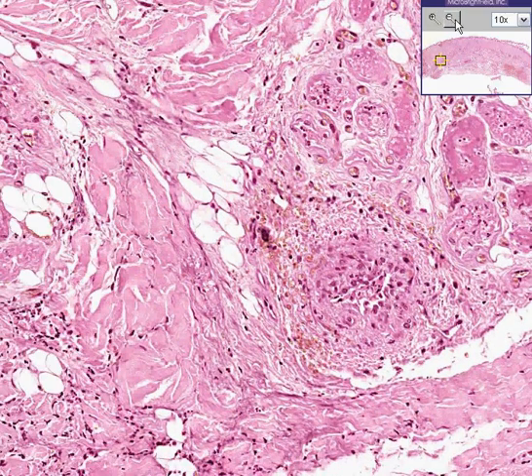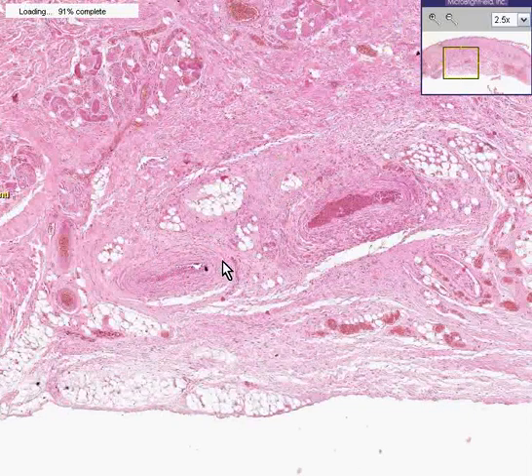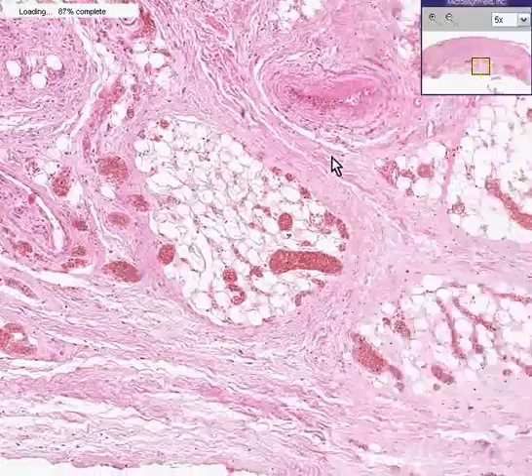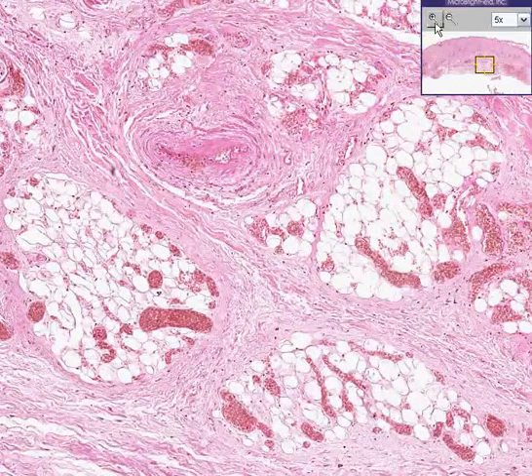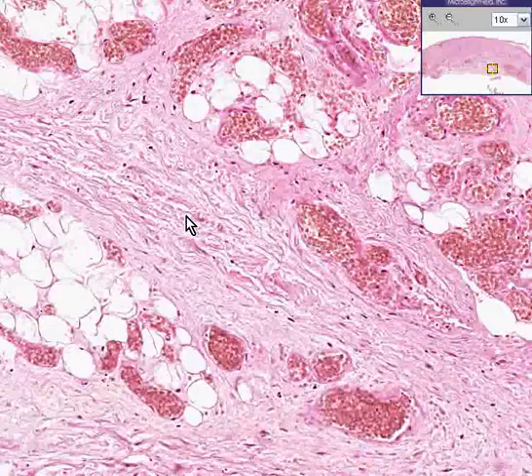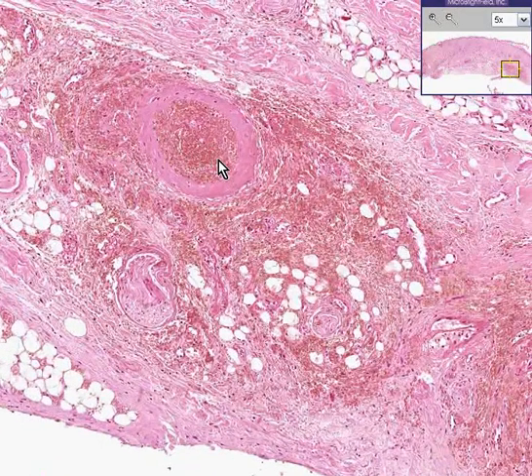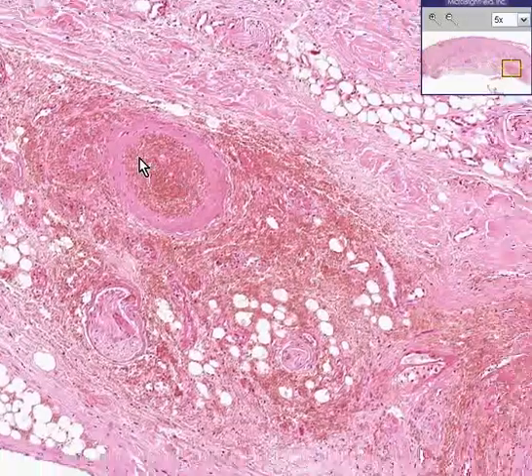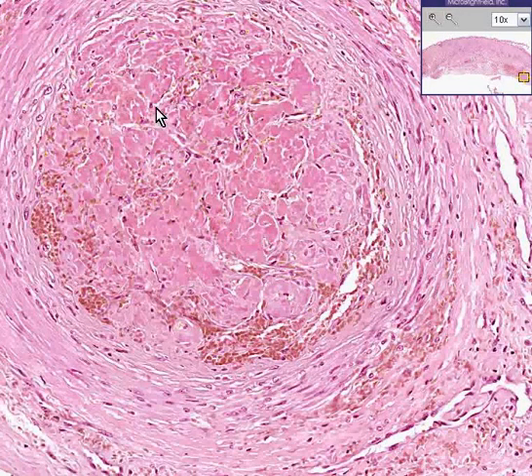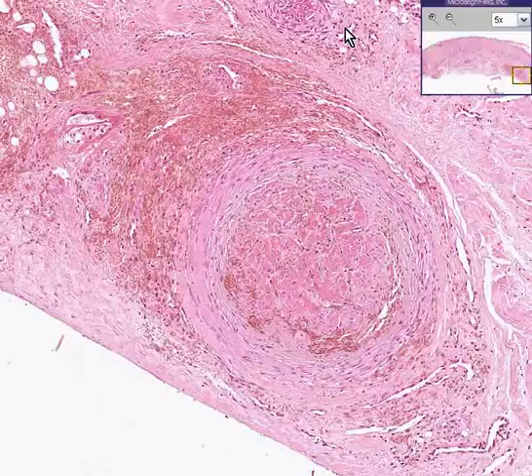Why might that be? Well, if we keep looking around at the skin, you can see that there is a very, very thickened arterial vessel here in the deep dermis, and I think you could see another area, besides having a thick atherosclerotic vessel here, in which you could see some degeneration of the blood wall. Here's another area in which you may even say that there is a thrombus within an arterial vessel. This is not congested blood — this is fibrin. This is infarcted skin, because the appearance of the skin is basically one of coagulative necrosis.